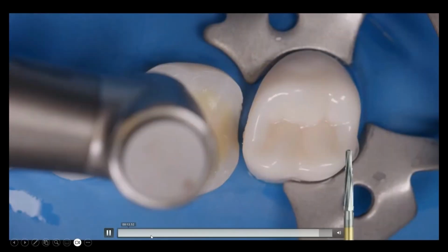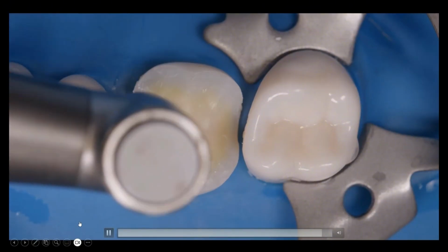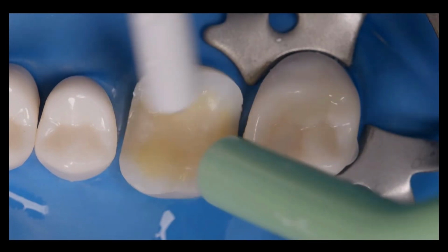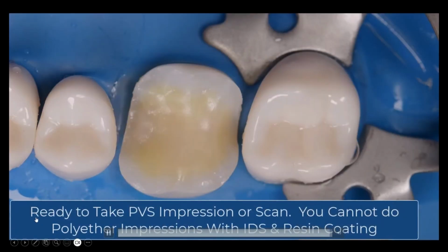Okay. So in doing that, the next step is to make sure you clean everything off. You're going to scan this. Some people scan with the rubber dam in place, which the lab would probably have no problem with. But now here's the last thing I want to point out to you. This is the other pearl. You cannot use Impregum to take an impression on a preparation that has IDS or resin coating. It just will tear. It won't work. You're going to have failure.